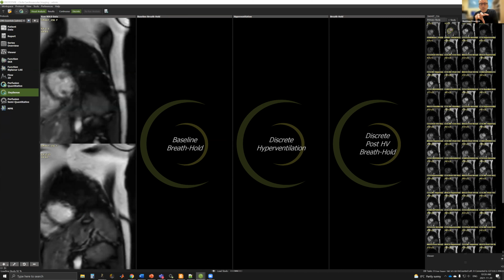Another one, Mitchell, to you: when the contouring, we of course have to be quite concerned about partial volume effects with the blood. So a question to you is, does this map that the tool generates here, do these maps actually need the contouring, or is this a map that would be generated for the entire image and the contours just select those that are visualized on the screen?